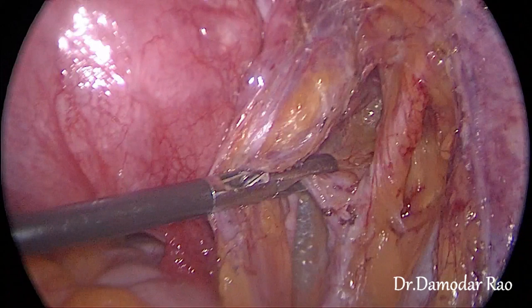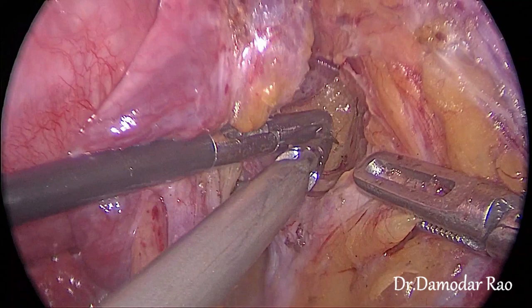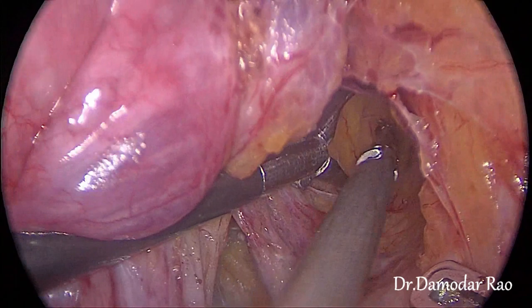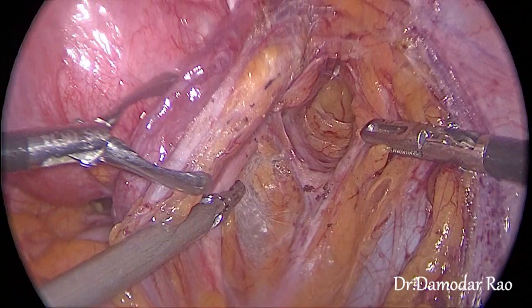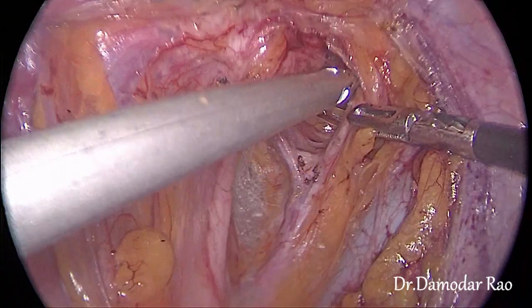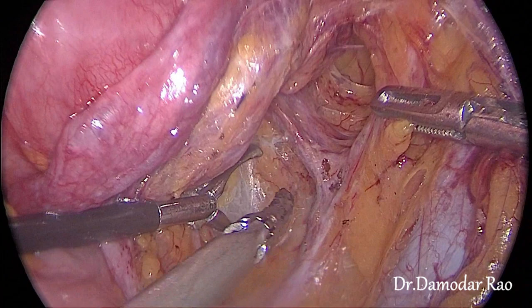You can see that the uterine artery divides the space anteriorly into the paravesical space and posteriorly into the pararectal space. I am further dissecting out the paravesical space, whose boundaries are the uterine artery posteriorly, the obliterated umbilical laterally, and the round ligament anteriorly. As you go further down you can see the levator ani, which is the inferior boundary for your radical hysterectomy dissection. You can also see the obturator vessels briefly in that space, and the internal iliac giving rise to the uterine artery and obliterated umbilical artery.